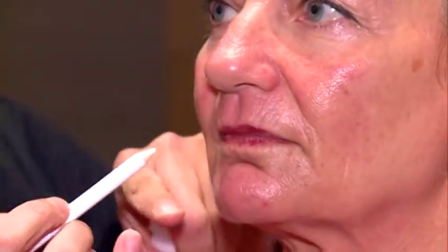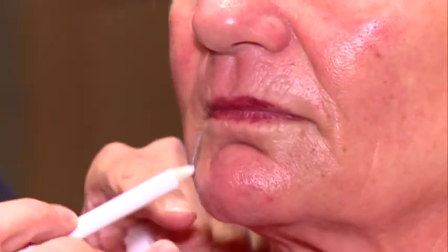Next time we switch, I do your talk, you do mine. Okay, so, and then we can do the marionette, sorry, just look at the camera. So we can also do the marionette lines if you want, because we don't want her to turn into our Chancellor, Angela Merkel, as long as she's in charge.